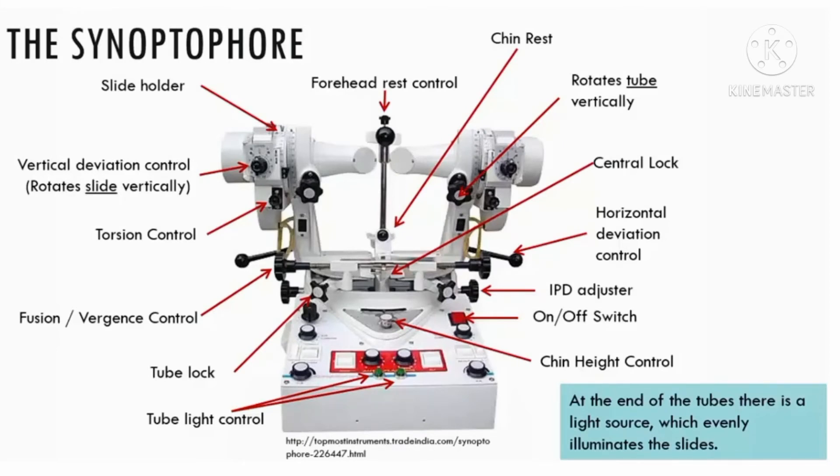Eyepiece and lens holder: eyepiece is plus 6.50 sphere. If the patient has refractive error and you want to perform the test with correction, or if you want to introduce accommodation, then we put the lens in the lens holder and perform the patient's further examination.